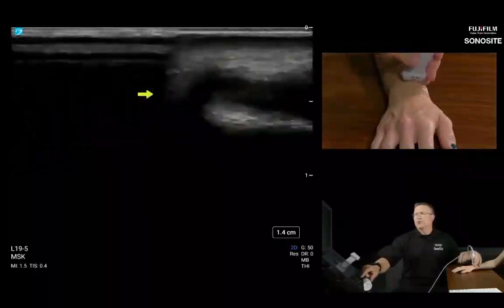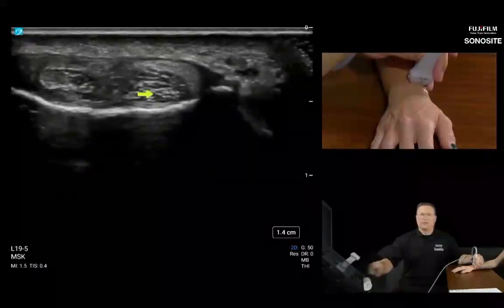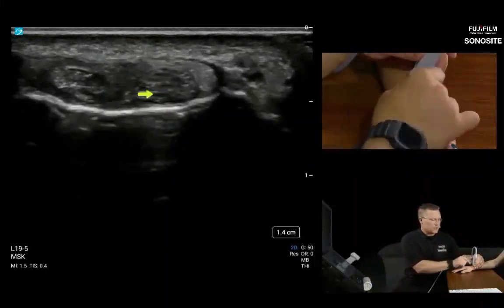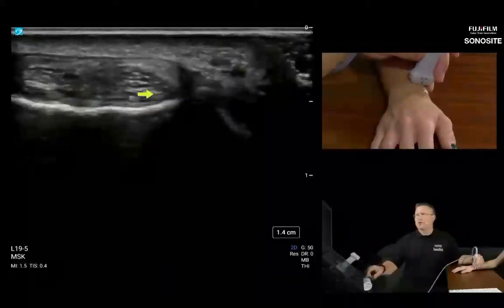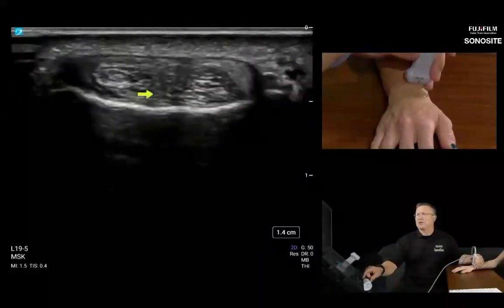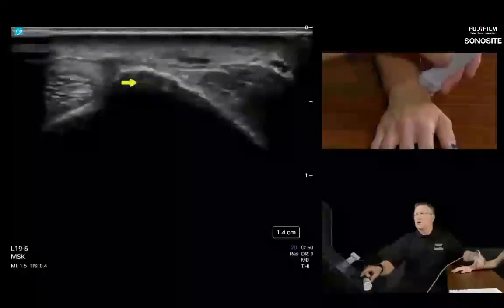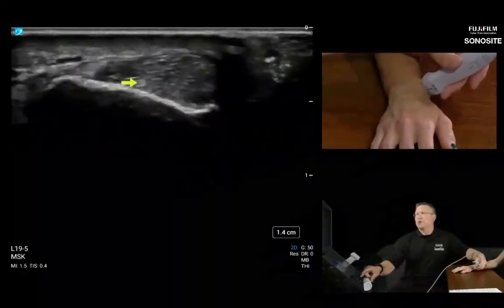What I'm going to do is just roll the probe, staying 90 degrees to the radius. I don't want to lose my angle. I can't just translate the probe over. I won't get a good shot of these compartments. You have to stay 90 degrees to the cortex. And I'm going to keep rolling. So this is compartment 2. Here's compartment 1. There we go.